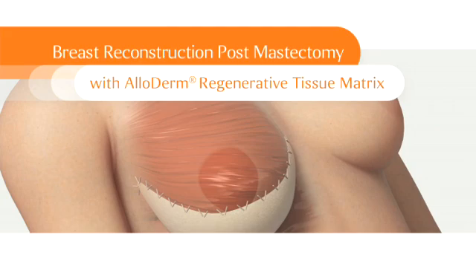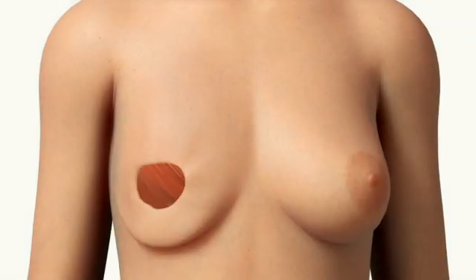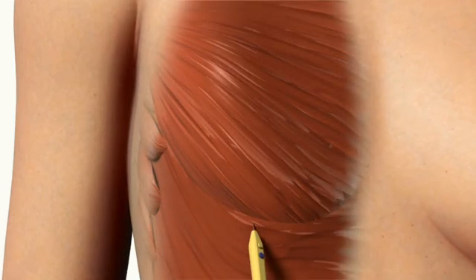Breast Reconstruction Post-Mastectomy with Alloderm Regenerative Tissue Matrix. Breast reconstruction is a type of surgery done to restore a breast after mastectomy, the surgical removal of the breast. Breast reconstruction can occur at the same time as mastectomy or at a later time as a separate operation. A plastic surgeon typically uses the existing skin incision that was created by the breast surgeon in performing the mastectomy.